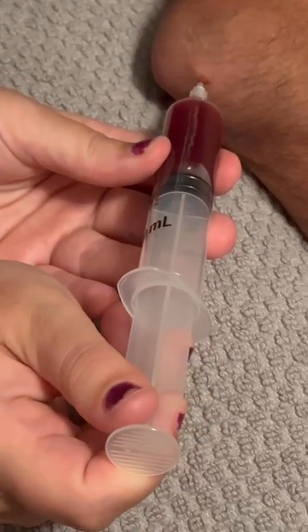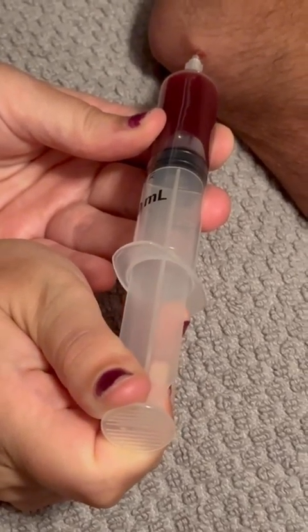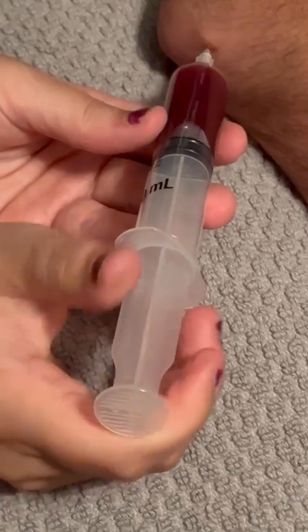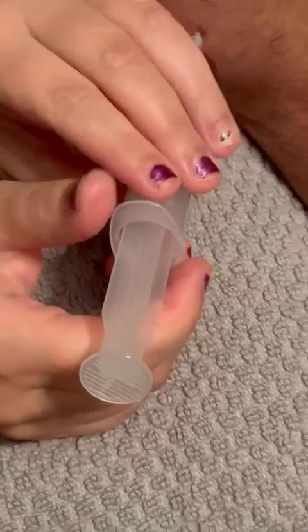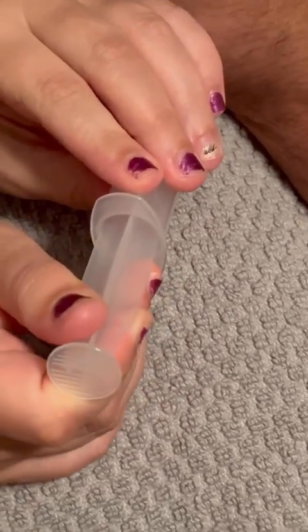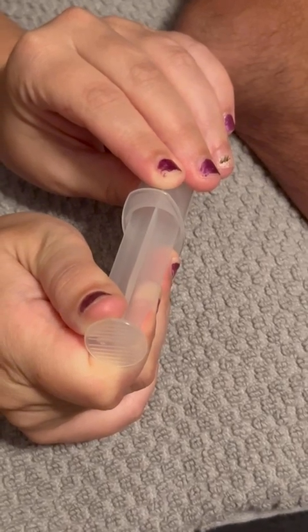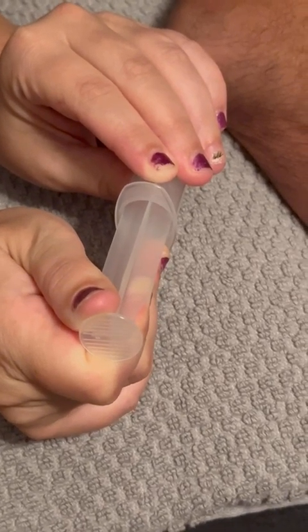It's going to be done. Maybe you're done. You want me to hold that? I'm not done. You want me to hold the actual syringe while you pull it back, Paige, or what? Well, I don't want to hurt him. I think he would tell you if you're hurting him. See, you're moving that needle around like inches at a time — that's an issue for me, but you're doing great outside of that.